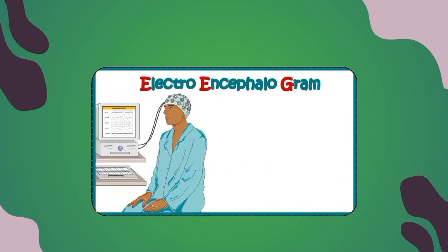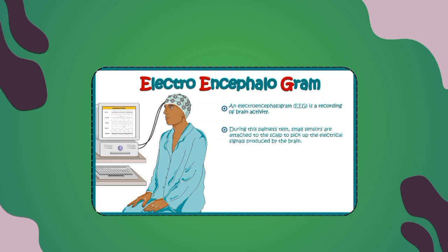Now, electroencephalogram is basically the output of the EEG machine, and these graphs represent the electrical activity coming from the brain. During this diagnostic test, a small sensor is placed all across the scalp to record the electrical activity coming from underneath the skull. And this is generally non-invasive and painless. These signals are recorded by a machine, and the doctor can interpret the meaning of these signals.